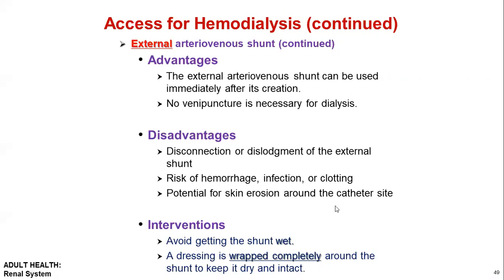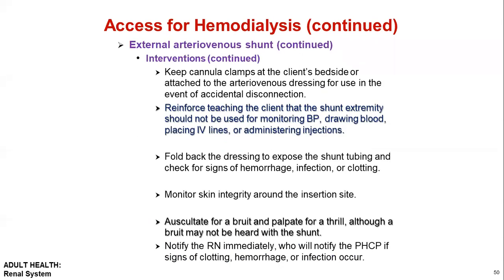What are the interventions? So when taking care of the patient who undergoes hemodialysis, always try to avoid getting the shunt wet, and always wrap the dressing completely around the shunt to keep it dry. What else? What are the other interventions?